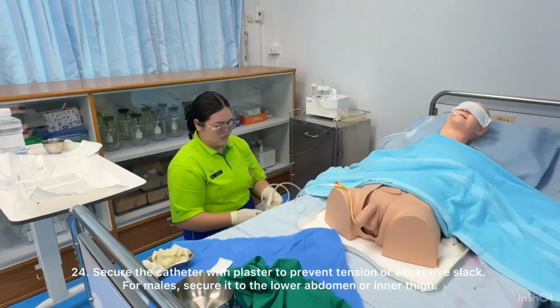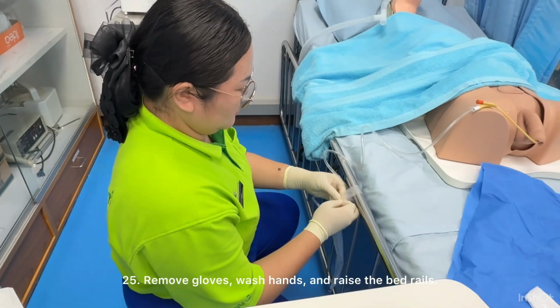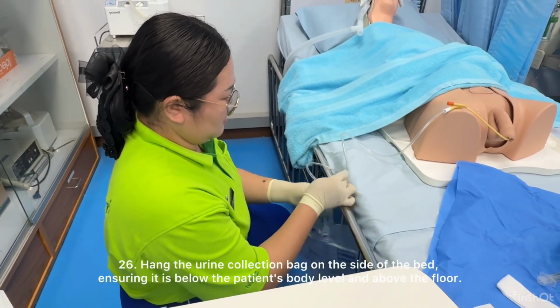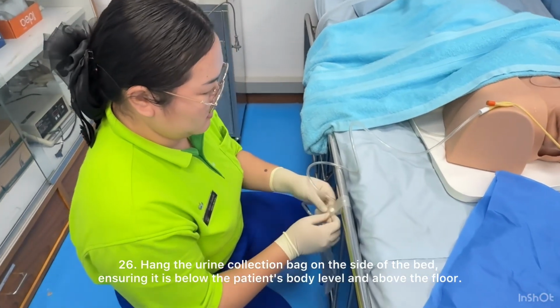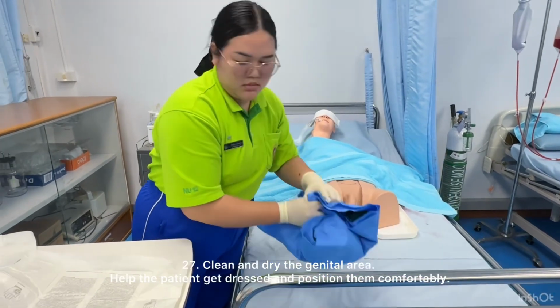For males, secure it to the lower abdomen or inner thigh. 25. Remove gloves, wash hands, and raise the bed rails. 26. Hang the urine collection bag on the side of the bed, ensuring it is below the patient's body level and above the floor.